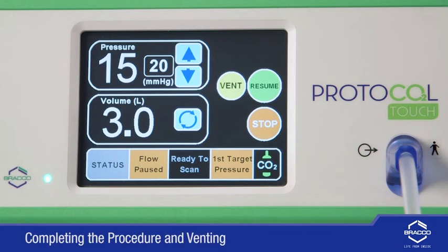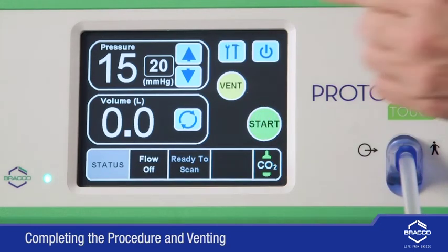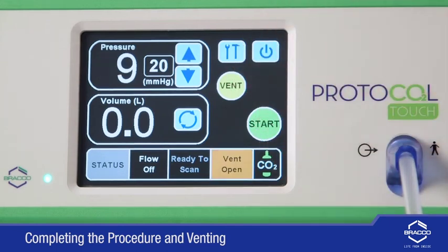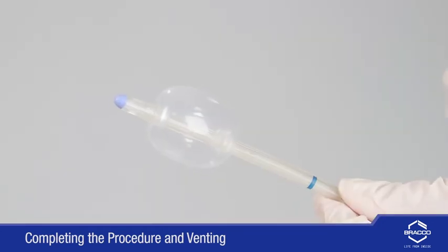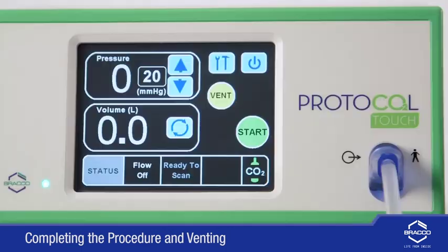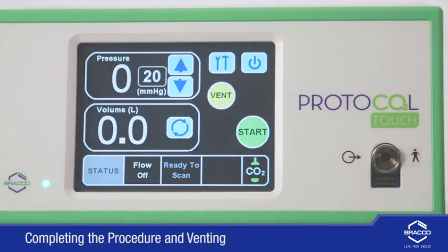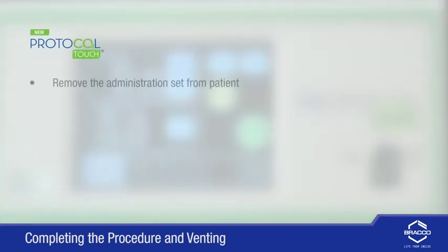Upon completion of the screening procedure, press the Stop button. Press the vent button to allow unit and colon to deflate and reduce pressure to 0. Once the pressure has achieved 0, prepare to remove the administration set at the output port. Deflate the retention cuff on the administration set prior to removal. Disconnect the Protocol Touch administration set from the unit at the output port. Remove the administration set from the patient.